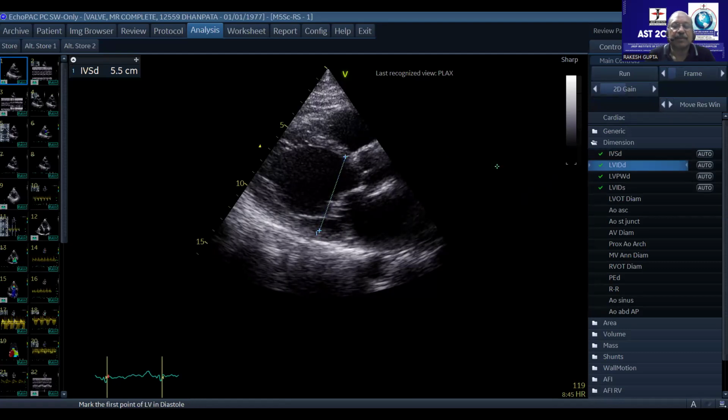GE. All GE machines have ECG facility. So go back and use your ECG. And I'll tell you honestly, you can use this electrode as many times as possible. Two to three times they are valid. Thank you, because we have to look at the conservative aspect of our country.